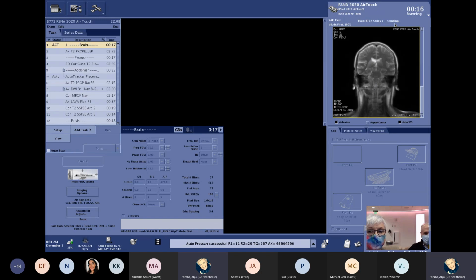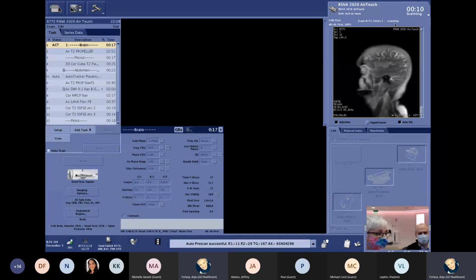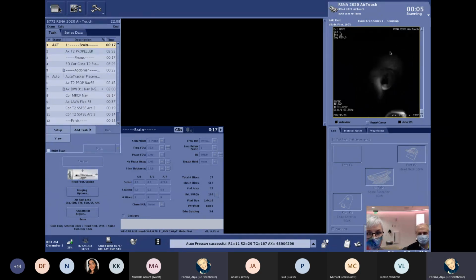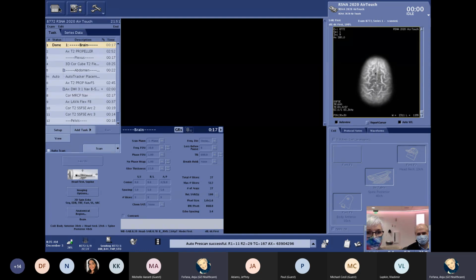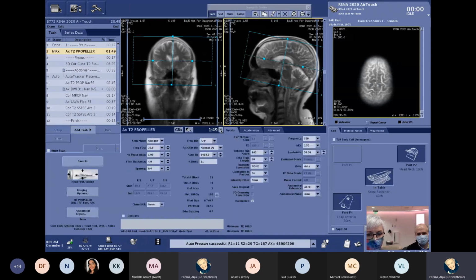So after the 17 seconds, the scanner knows exactly where the coils are and will pick accordingly, which really makes it easier on the technologist. So I can move now freely through the body, and when I want to know where the coils are in a certain body part, the system will always generate this sensitivity map and will plan accordingly. So we will start in the brain.